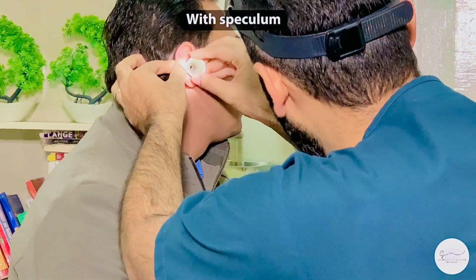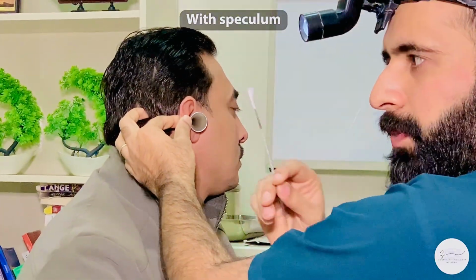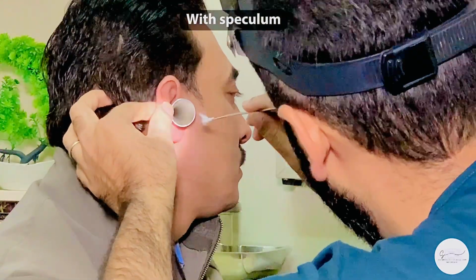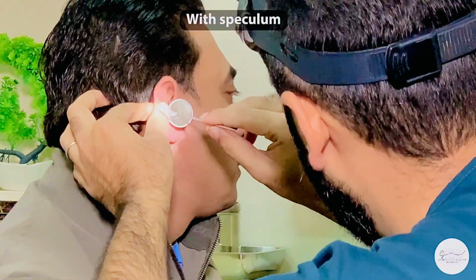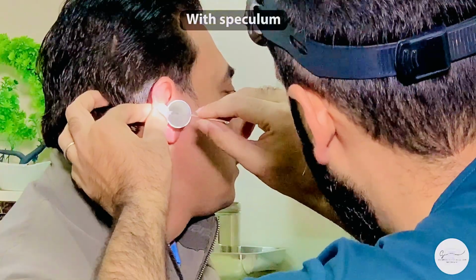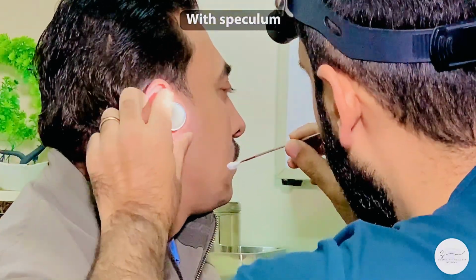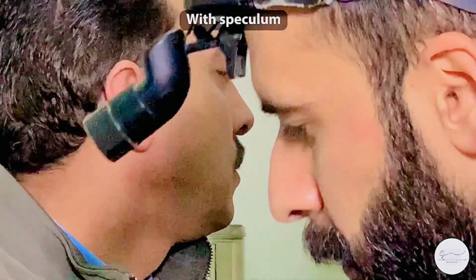And if there is any debris that you may find, you need to clean it out with a Jobson horn probe. So this goes gently in, and the same movement, you should be rotating the Jobson horn probe to clear out any debris that might be there. After that, you take the speculum out, and if there is a discharging ear, you should always smell the speculum to see if there is any foul smelling discharge that may be present inside the ear.